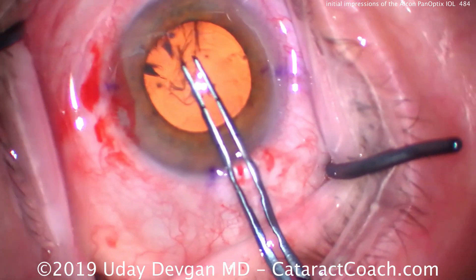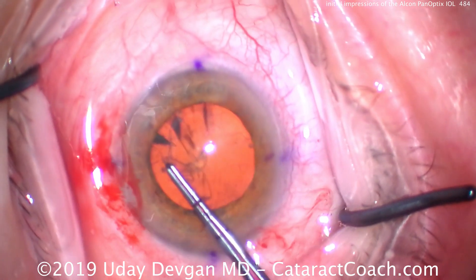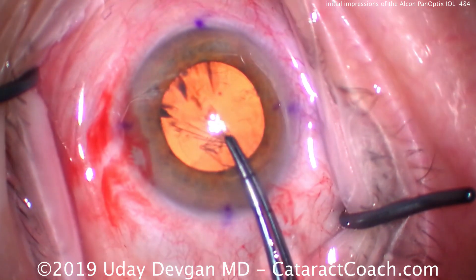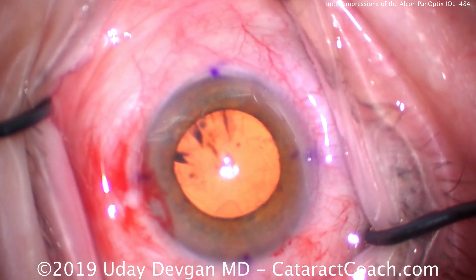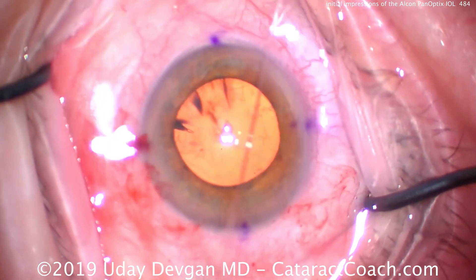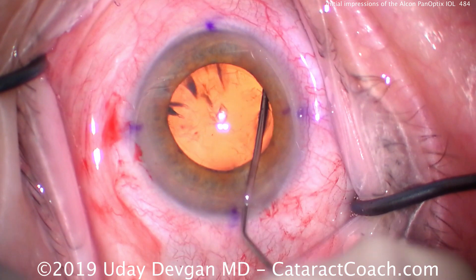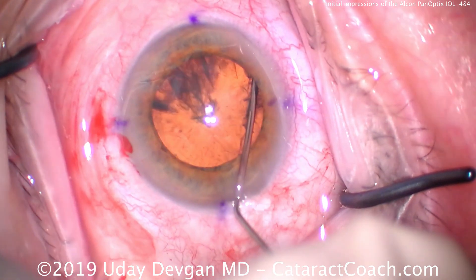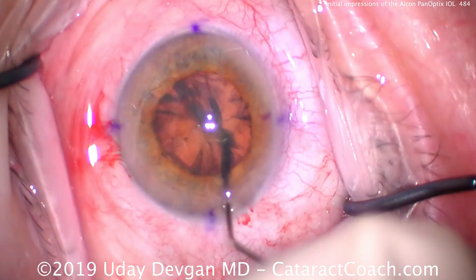I do commend Alcon for coming out with a product in both the natural tint as well as the non-tinted version. The lens comes in toric powers to correct about two — maybe a little bit more — diopters of astigmatism, and that covers the vast majority of the population. This lens has provided pretty good results and patients are pretty happy.